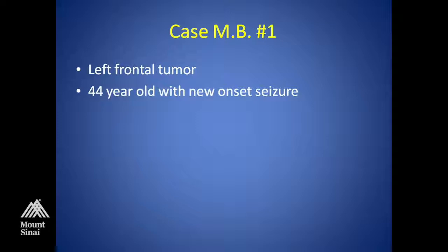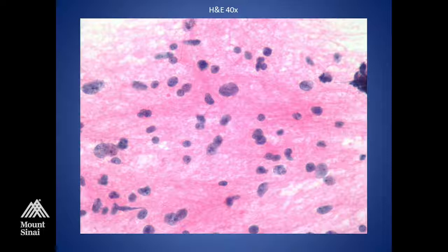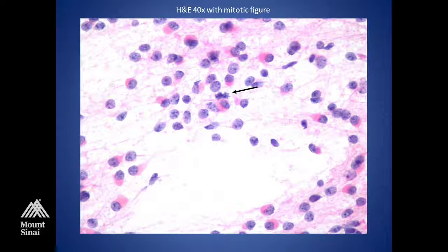The next case: left frontal tumor in a 44-year-old with new-onset seizures. The smear shows a neoplastic infiltrate of a monomorphic population of cells. The cells have very scant cytoplasm. The nuclei are relatively round with fairly open chromatin, and there are cell processes — some fibrillary processes. There is some pleomorphism to the nuclei, and some nuclei are a little bit larger than others. And there are mitotic figures.